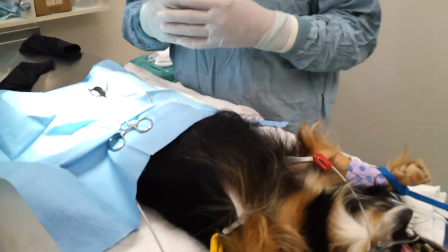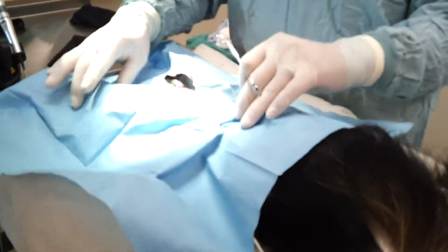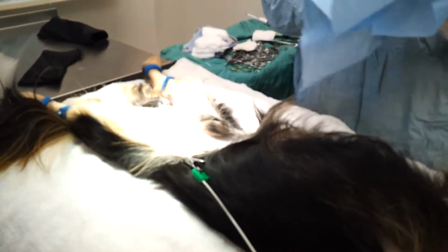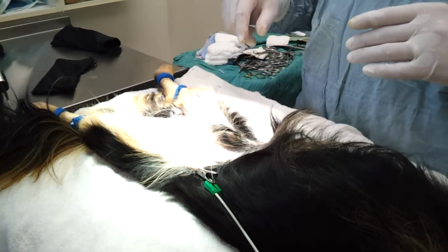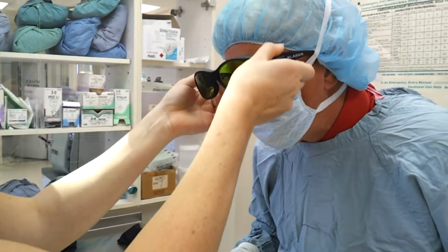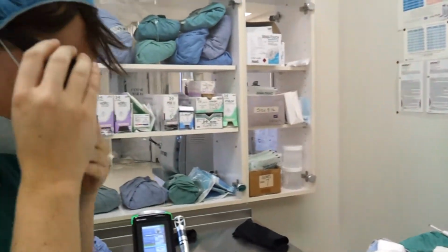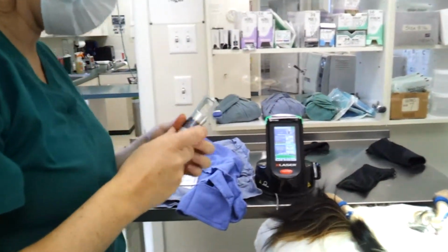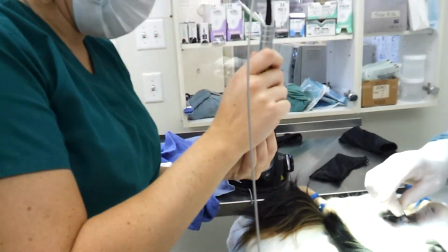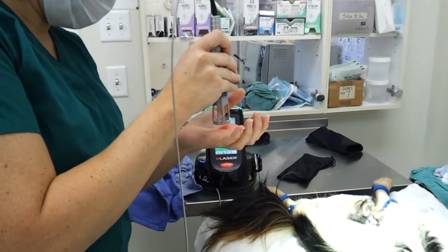Our little patient here, Roscoe, has just had a neuter surgery. He had his castration surgery. So when we're done with the surgery, what we do is we'll go ahead and take his surgical drape off, and then we'll give him a laser treatment. Laura, our technician here, will show us how she does that. So we'll go ahead and laser the sides of the incision. We make sure that it will increase the healing process.